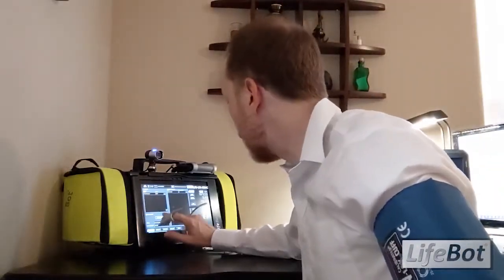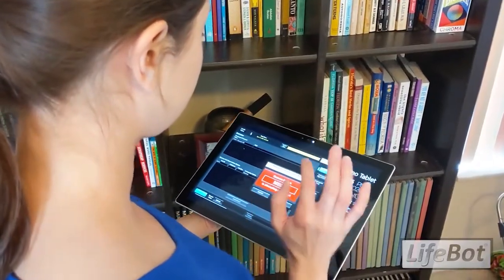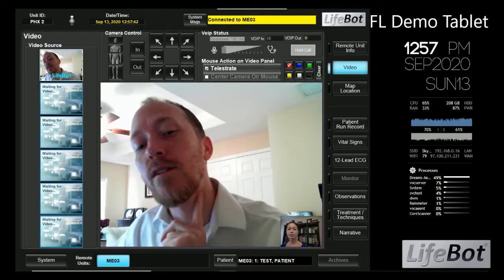And now it's time to make a call to a physician. The physician will receive an incoming call from my system. When the call is accepted, the video link is established. The physician will immediately see the vital signs of the patient as well as the patient's video.